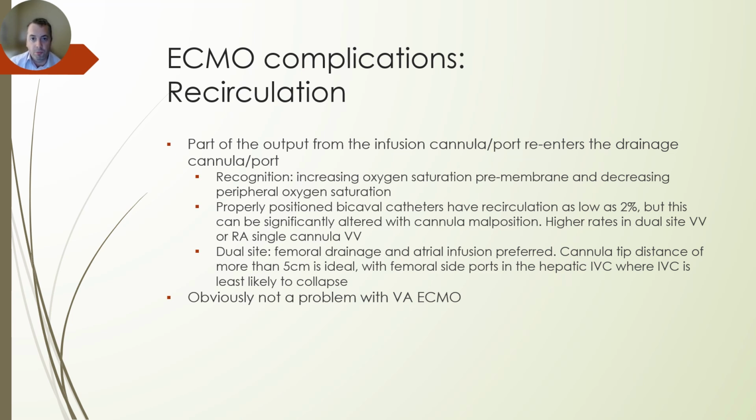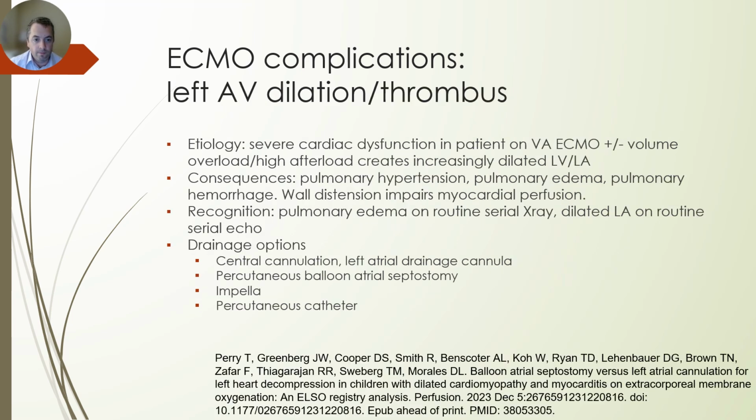It's obviously not a problem with VA ECMO, as the catheters aren't in the same area. All right, left AV dilation and thrombus.